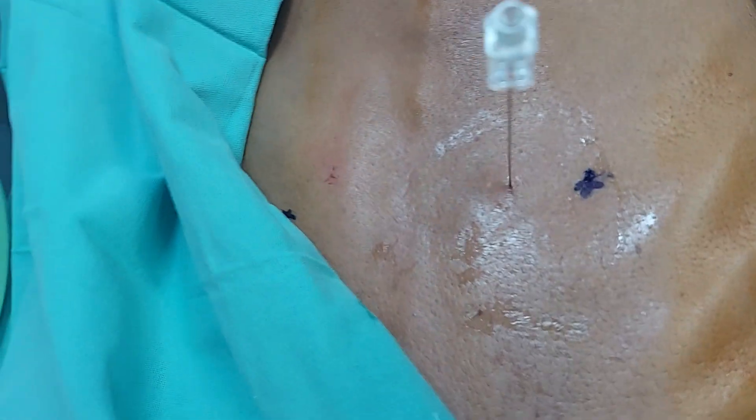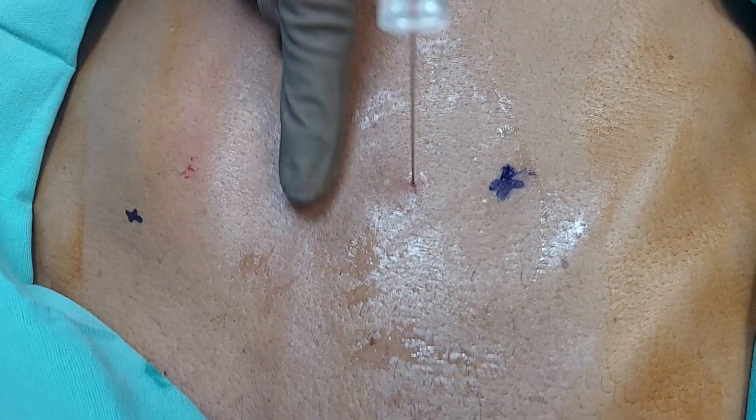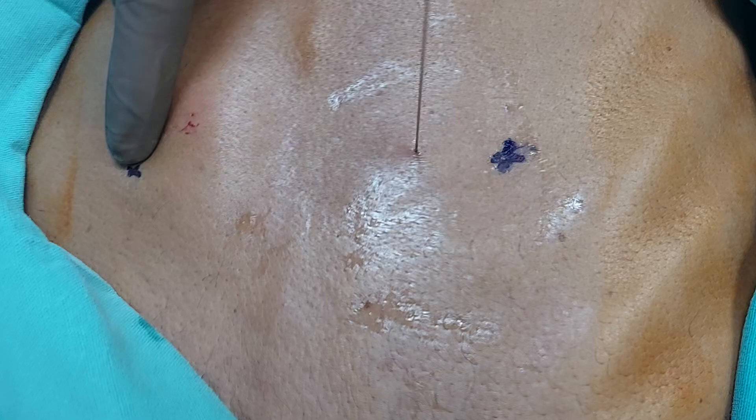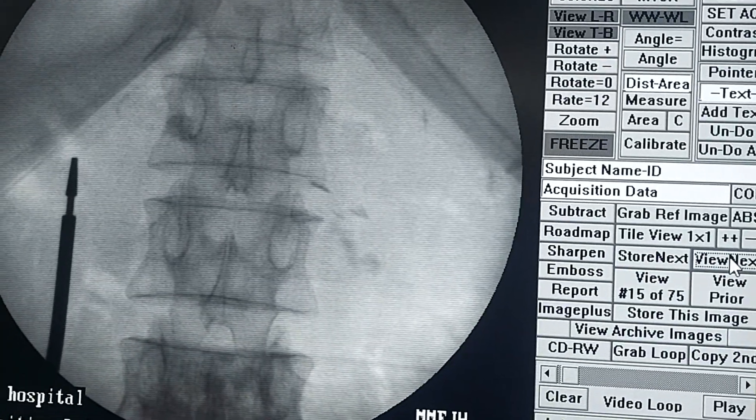Marking for the splanchnic nerve block from the midline — a four centimeter marking is done on either side. You can see that the needle entry is within that four centimeter range.